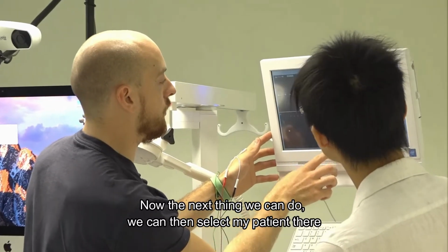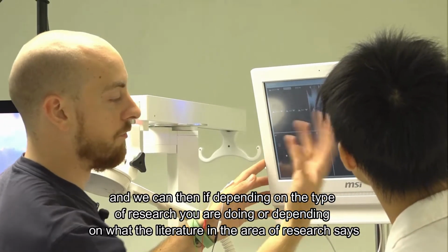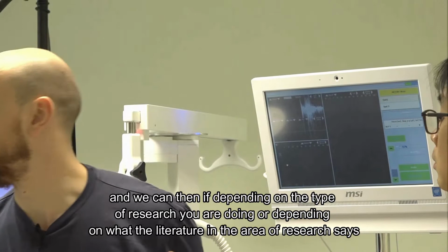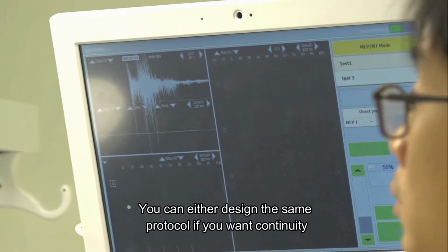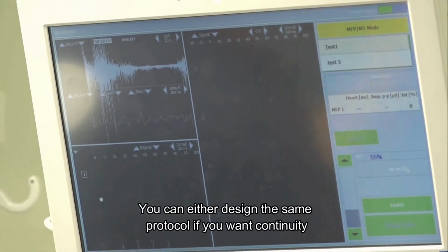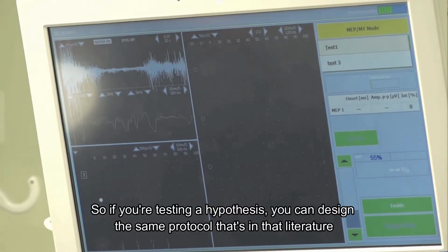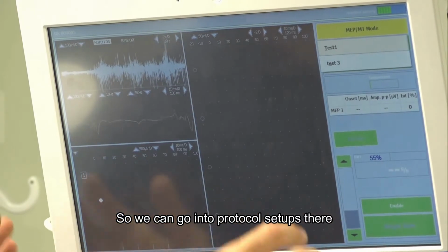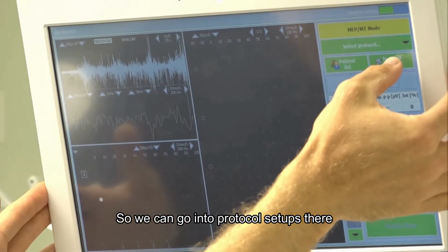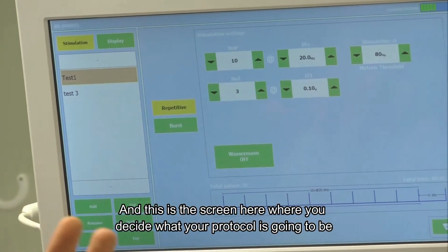Now the next thing we can do, we can select that patient there, and go into select our protocol. Depending on the type of research you're doing, or what the literature in your area says, you can either design the same protocol if you want continuity, if you're testing a hypothesis, or you can come up with a slightly different protocol to try a new hypothesis. So we can go into protocol setups there, and this is the screen where you decide what your protocol is going to be.